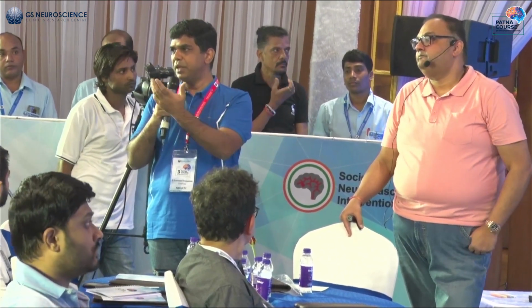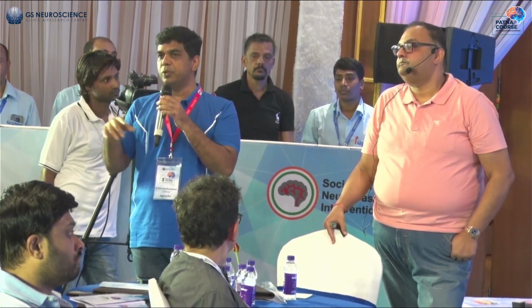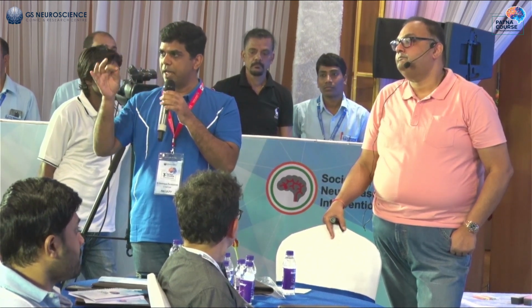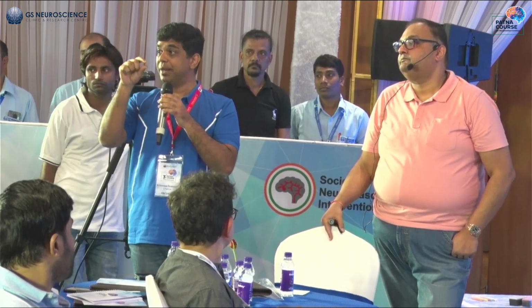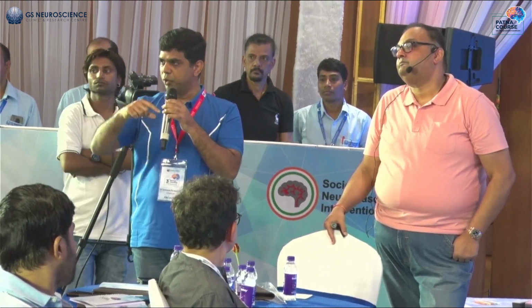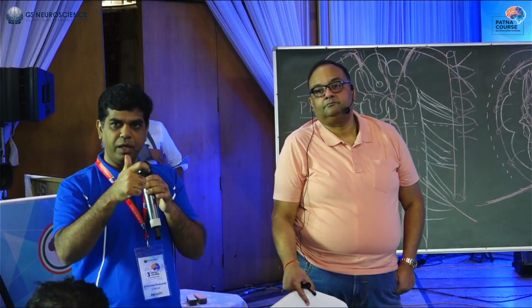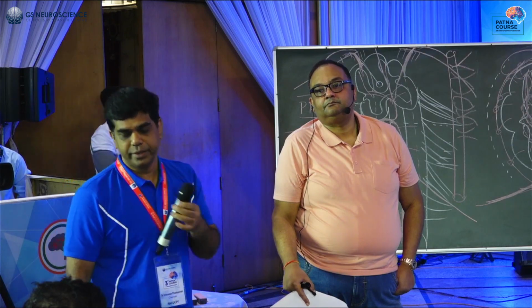As I told you, some people inject little glue and stuff. The standard technique used in the West is, after they localize the spinal fistula, they would just dorsally localize it and put an injectable coil in that region, close to the pedicle, because the nerve root is just below the pedicle. Close to the pedicle, they would put in the muscle an injectable coil. They would just inject it so it's easily picked up by the C-arm during surgery.